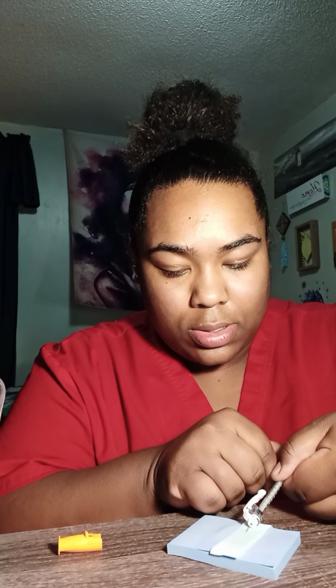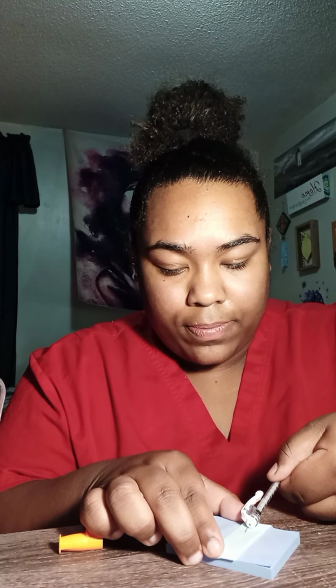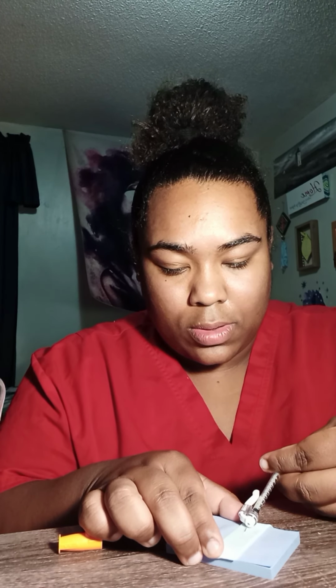Again, 5 units. I'm going to go down at a 5 to 15 degree angle. And, okay, push the medication. Make sure the skin is held taut. And we are done. Pull straight out.